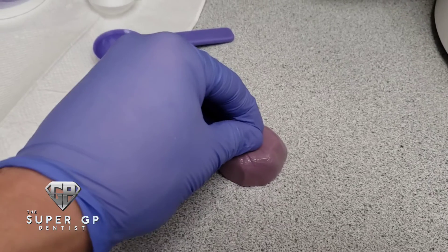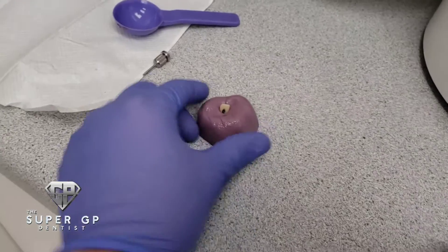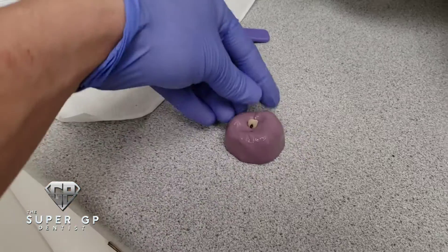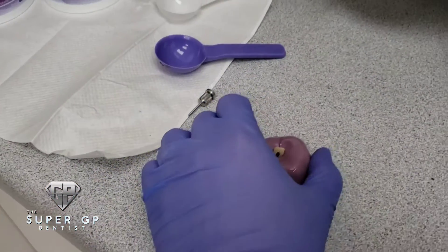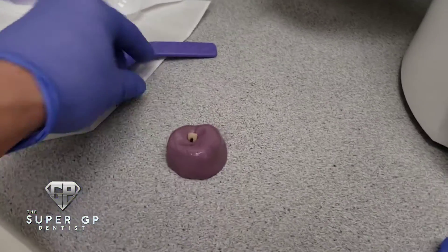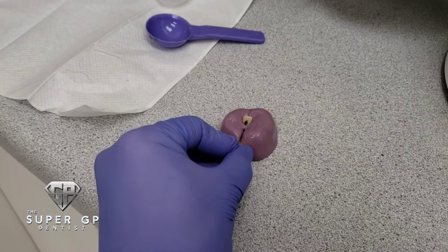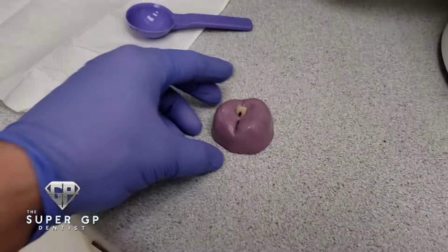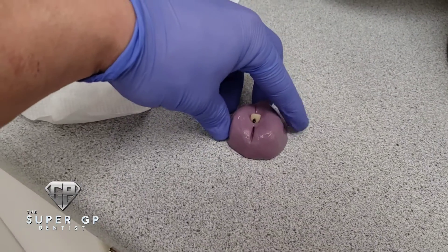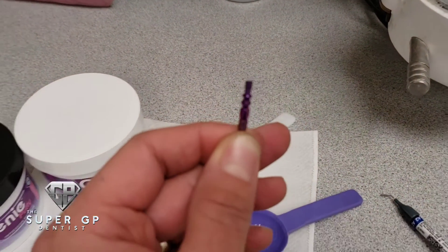I place the lab analog and temporary right onto that block and make sure it seats directly onto the table, nice and firm. Then I squish the material around the temporary to get a good impression. I usually go up to the height of contour — you want to give yourself access to remove the temporary crown once the material sets. I like to mark the buccal side just so I know where we're starting from, since you can get disoriented.